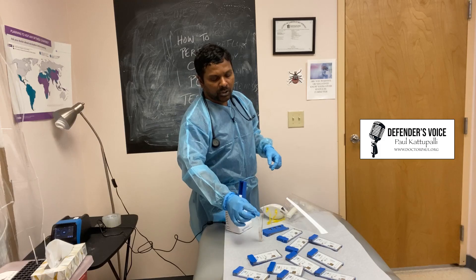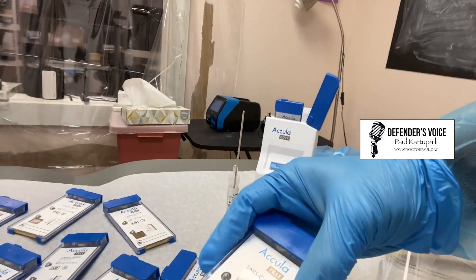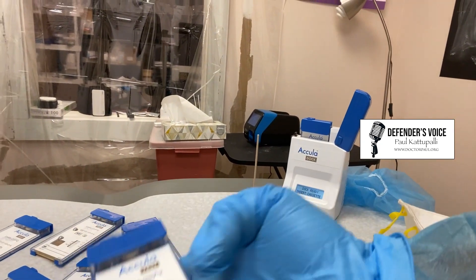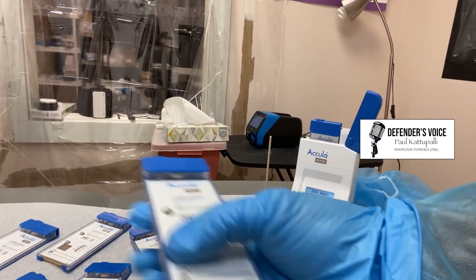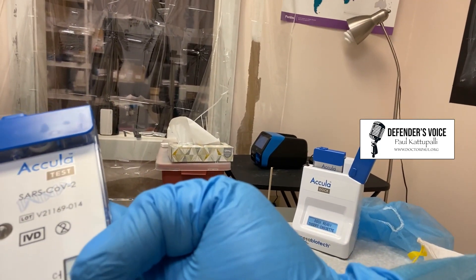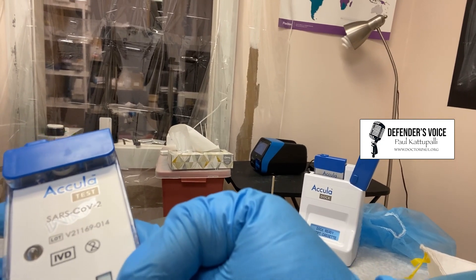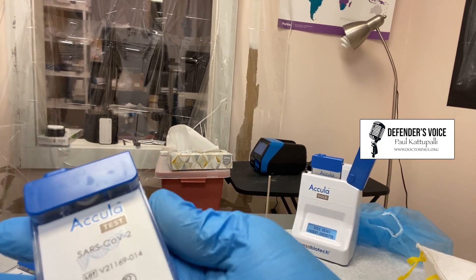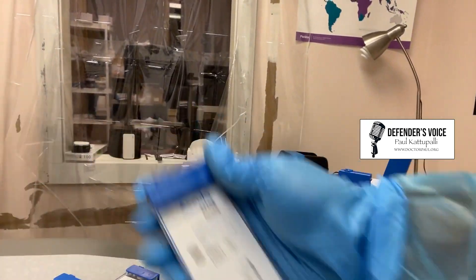Let me show you different tests I did throughout the day. This is a negative test — you will see C only. If there is a T, that is positive. Here you can see C and T. C is for control, and when T appears the test is positive. So this is a positive test — this patient has COVID. And this is a negative test.